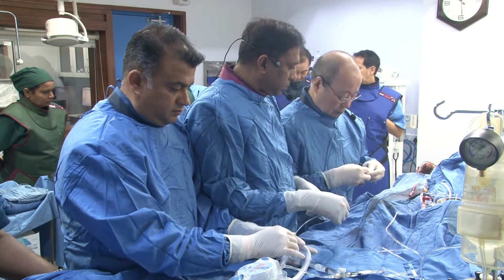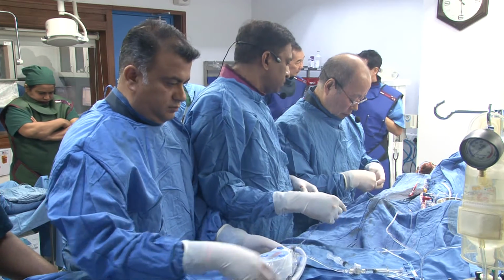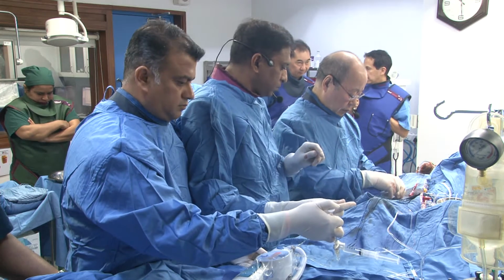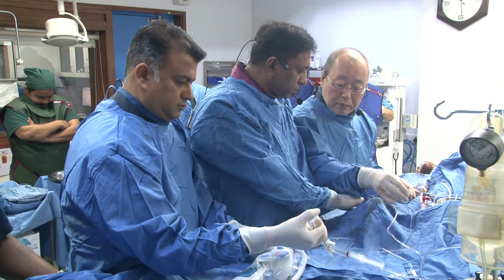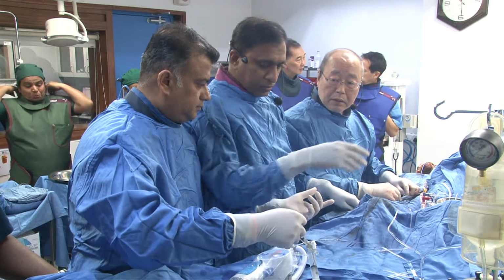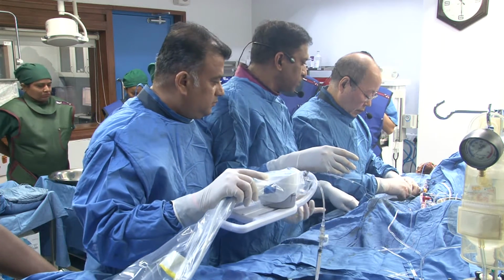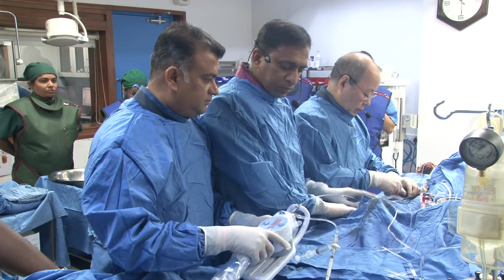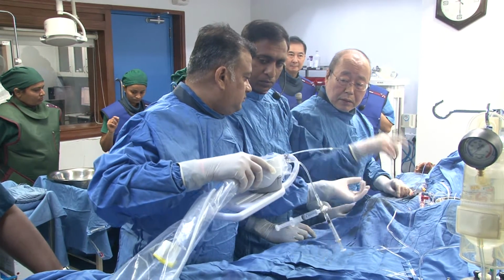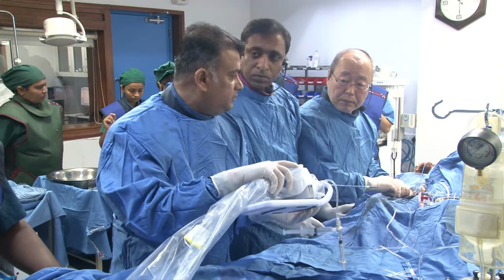But I think your point is a good one. In the old days, we would say subintimal passage or intimal tear was a contraindication to atherectomy, but nowadays we have no problems doing atherectomy. Do you agree, Tak? And the panel, you guys agree? You're not put off by some subintimal passage and intimal dissection? Absolutely. If you can't dilate, then yes, even if there is a little bit of a tear, we still rotablate.